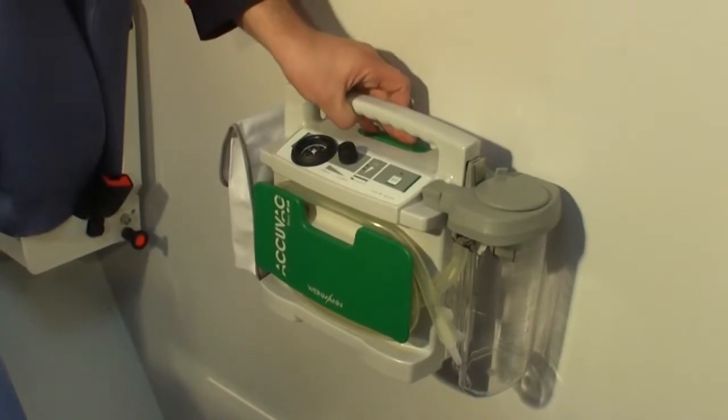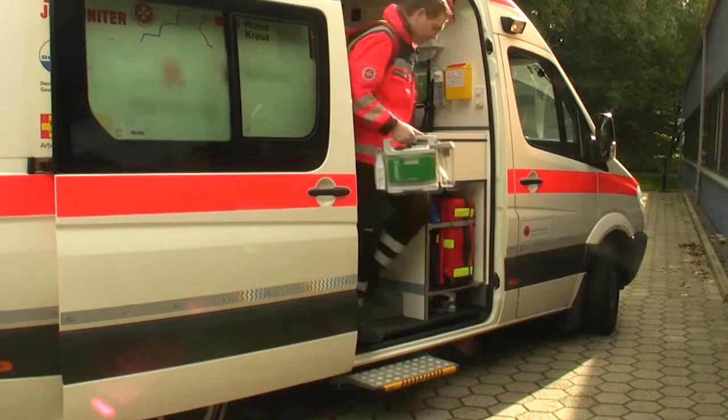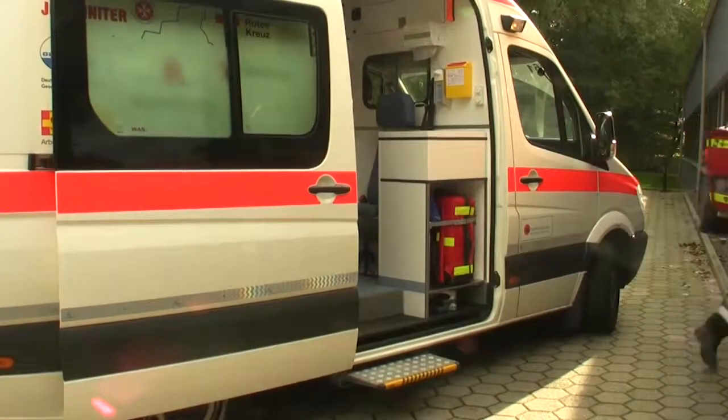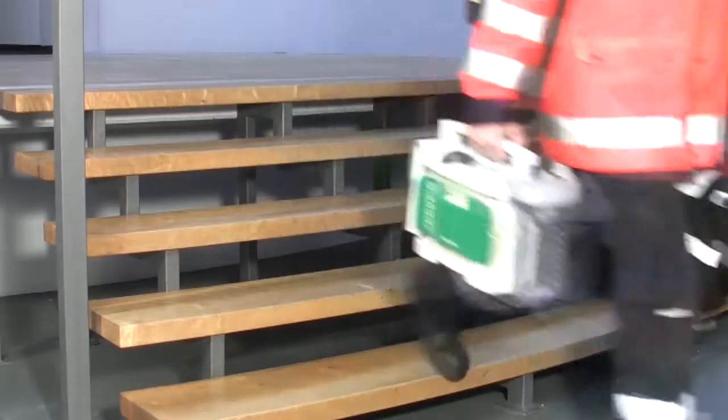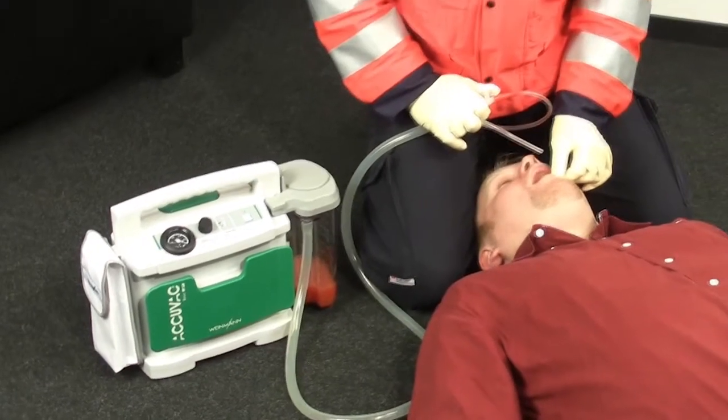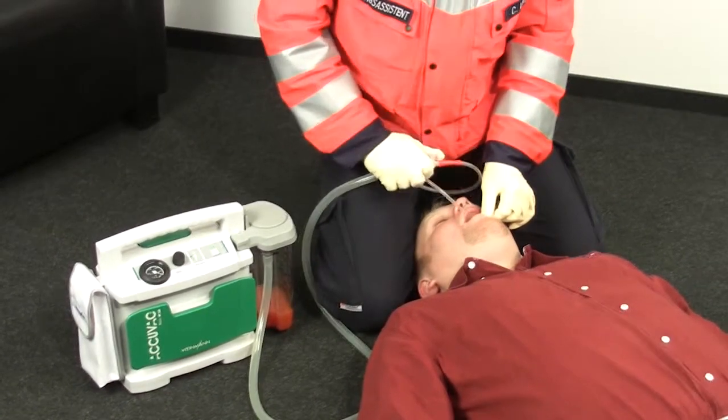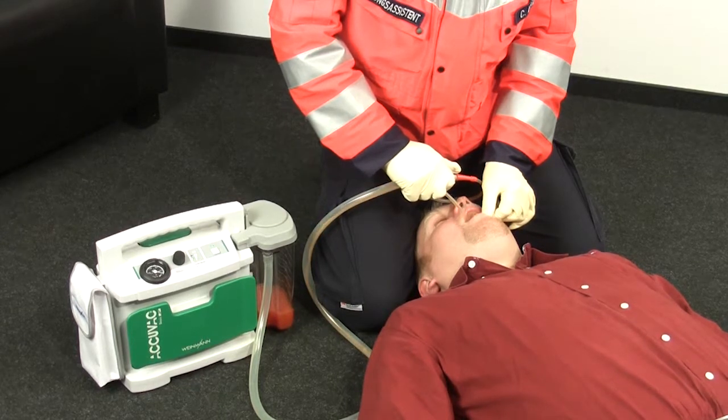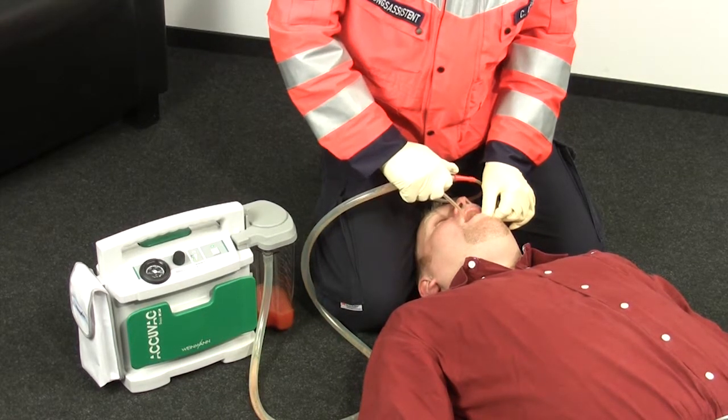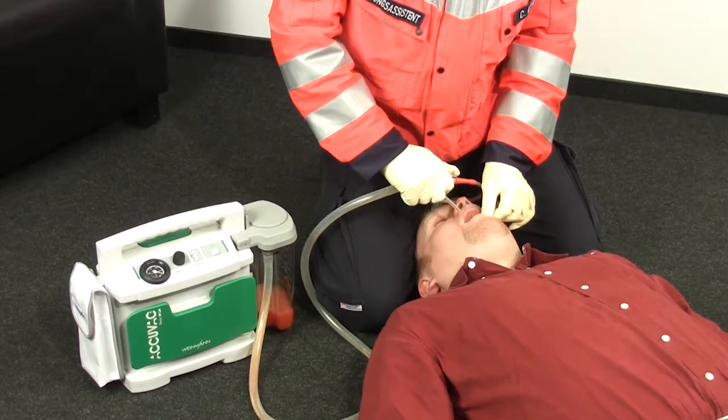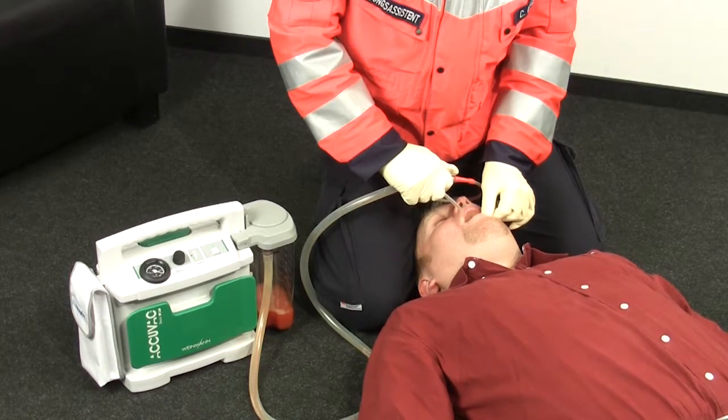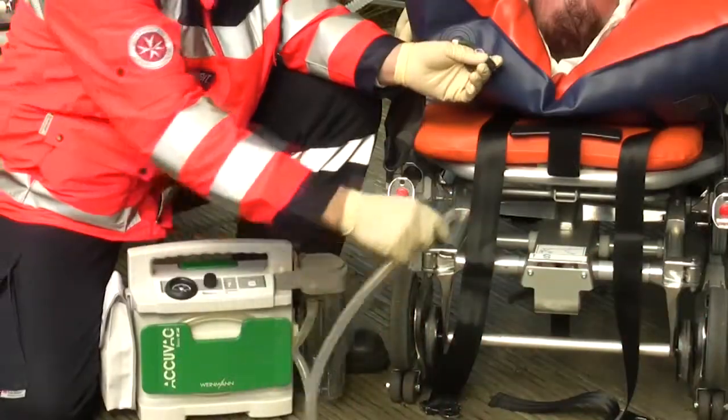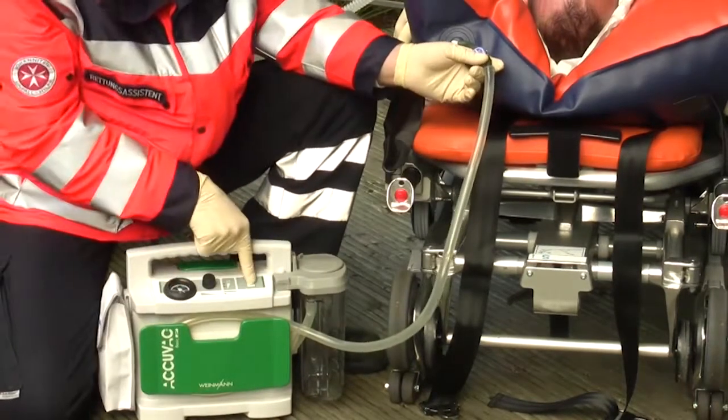ACUVAC BASIC is portable and can therefore be used inside and outside an ambulance. You can use ACUVAC BASIC one, to remove blood, secretions and food particles from a patient's oral cavity, throat and nose and bronchial system, and two, to deflate vacuum mattresses and vacuum splints.